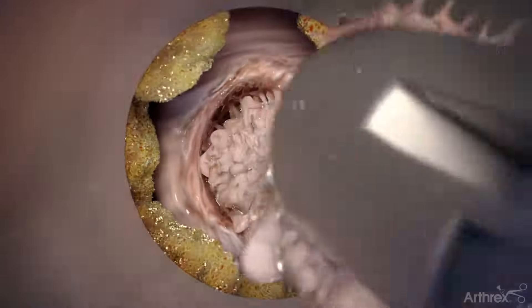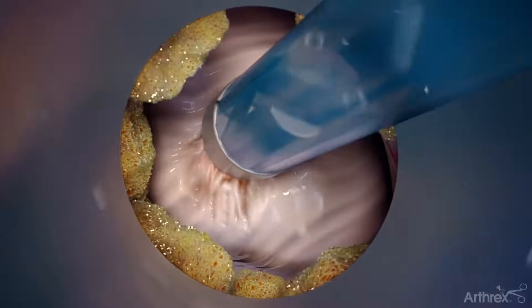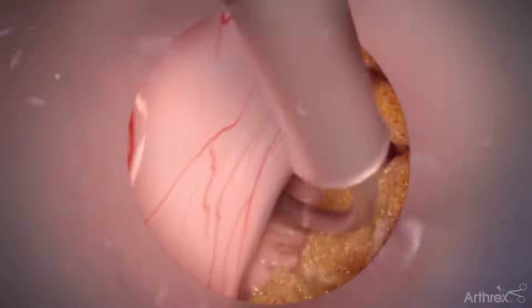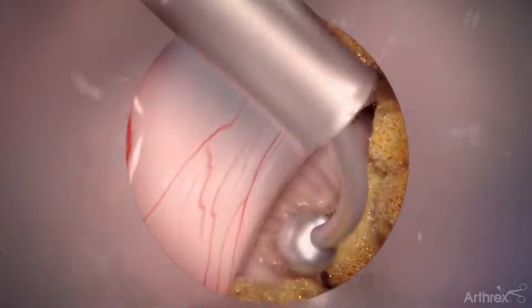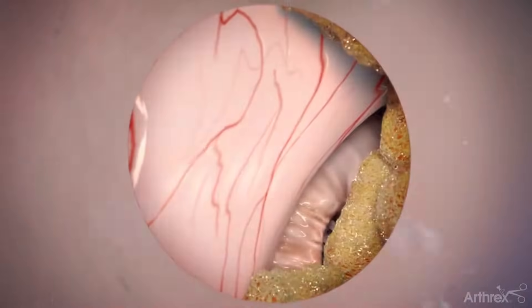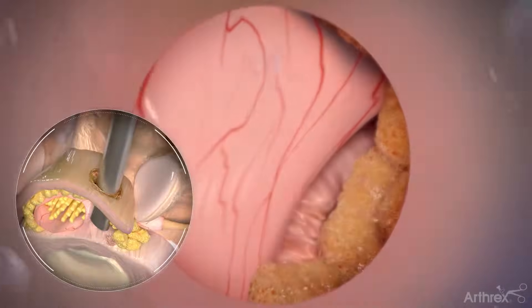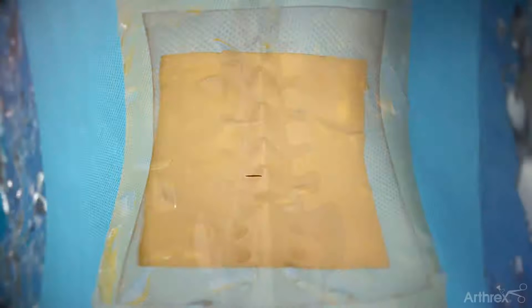Use grasping forceps to extract the exposed nuclear material. Use the electrosurgery probe to ablate nuclear material and minimize the annular defect. Once complete, slowly remove the scope and cannula.